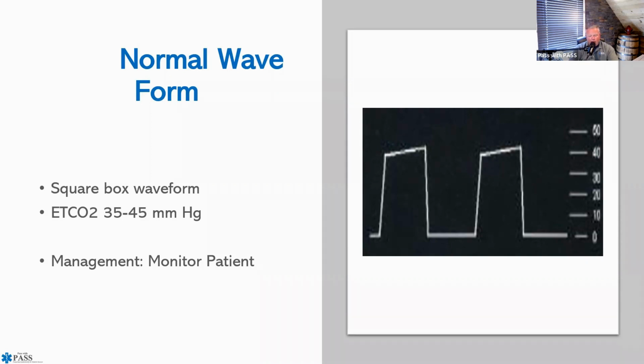And I know, by definition, that's probably more of a rectangle, but if we can all agree that we're going to call it a square, any variation of a square tells me that the tube is through the glottic opening if the patient is intubated. If they're not intubated, then it doesn't tell us where our ET tube is, but it does tell us if the patient is breathing, if they have an obstructive pattern, and so on, and we'll look at all of this.